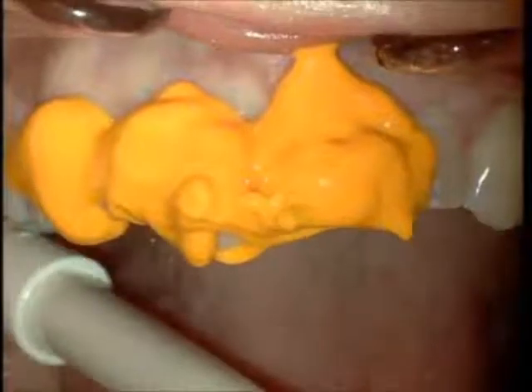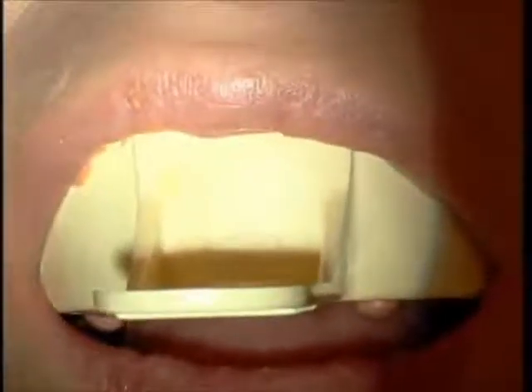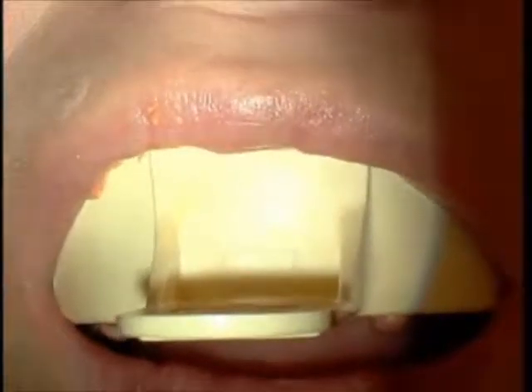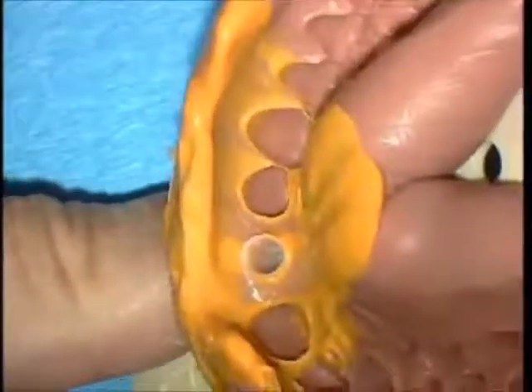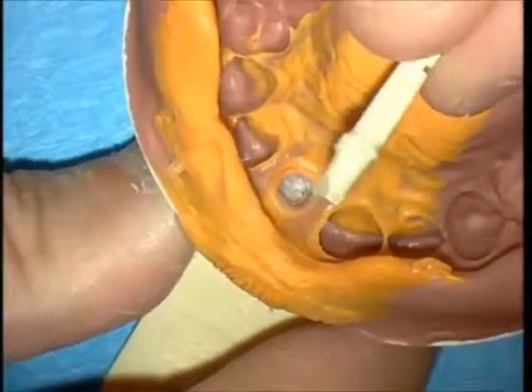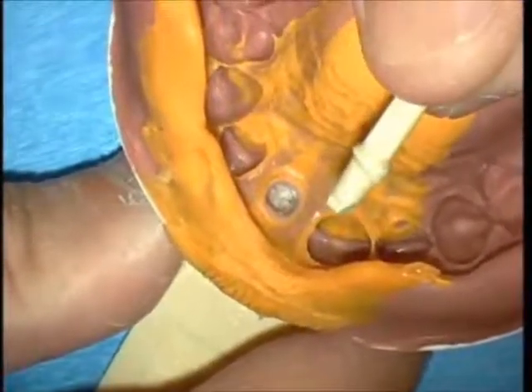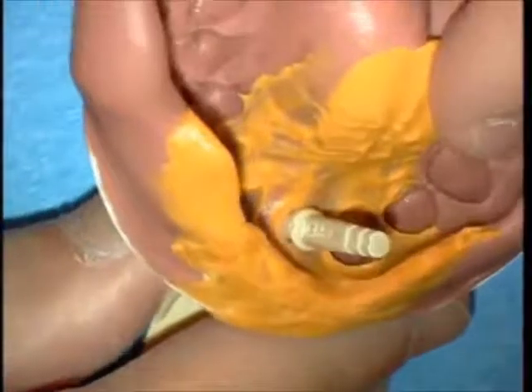Now this expedites things quite nicely because the abutment that we place can stay in the mouth, and that's a big advantage biologically because it maintains the bone without having to unscrew and screw on new parts at each visit. So this becomes basically a screwless system. The restorative dentist, if you're the surgeon, if you place and select this abutment, the restorative dentist doesn't have to play with drivers or screws because this never has to be removed from the mouth.